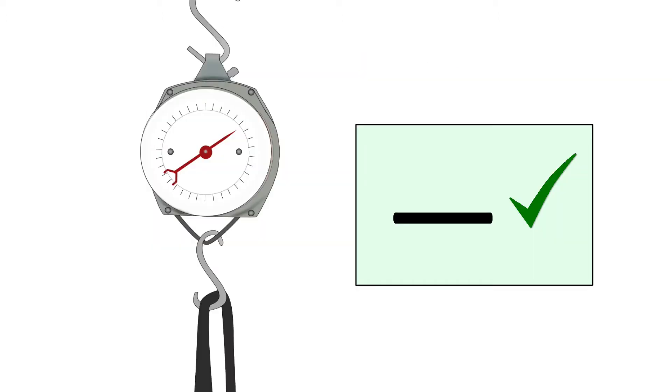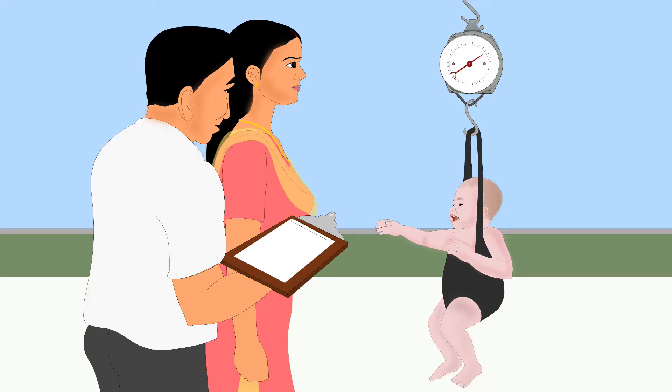Write down the weight immediately so you don't forget it. The scale must be checked every day by using a known weight. Do not forget to readjust the scale to zero before every weighing.